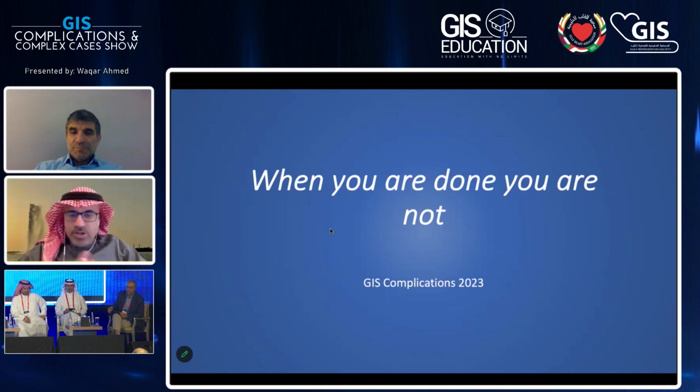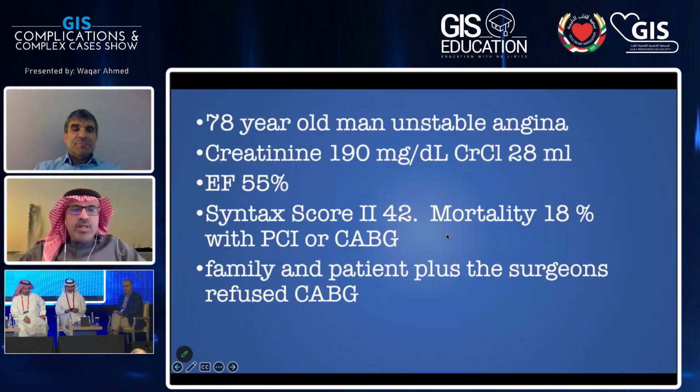And I wish I was there, but we can present the case from here. I was asked to present a dissection case, and it took me a long time to find one, mainly because of coronary stents that we take care of dissections very quickly, but we will go through this case. Okay, so can you see my screen? The organizer says we can.